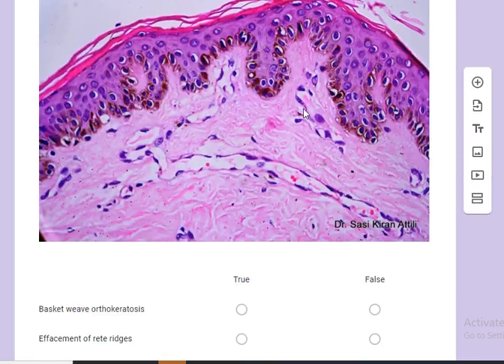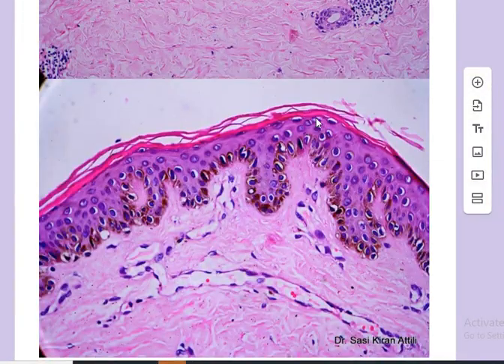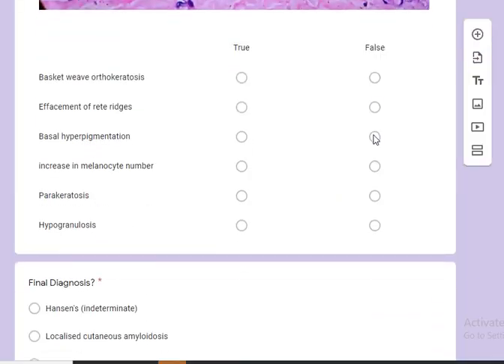The number of melanocytes is the same, but there is basal hypermelanosis, which can be seen in morphea and in fact any interface dermatitis. Morphea in the early stages can have interface dermatitis, and that's why there is an overlap with lichen sclerosus as well. So remember that. So there is basal hyperpigmentation, no increase in melanocyte number, there is no parakeratosis, but there is hypogranulosis. You hardly see any granular layer. In any atrophic process where there is epidermal atrophy, there is often hypogranulosis. I don't really know the answer why. Probably because of the epidermal atrophy, the granular layer is thinned out so much you can't really see it. But that doesn't mean anything. It's not diagnostic of anything, to be honest.